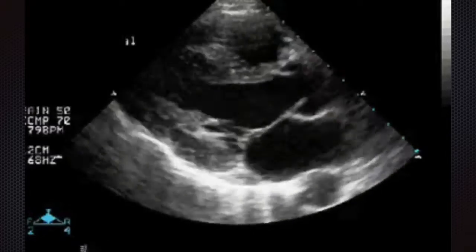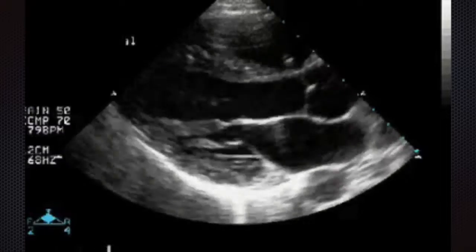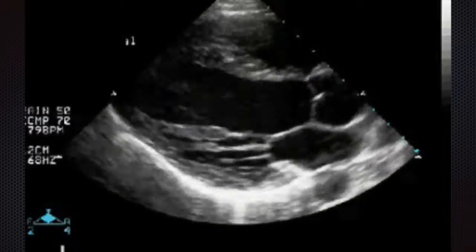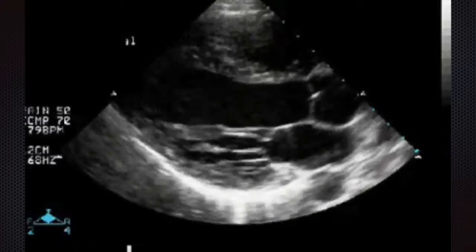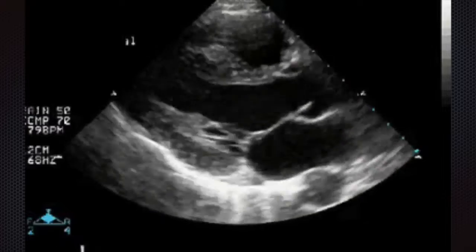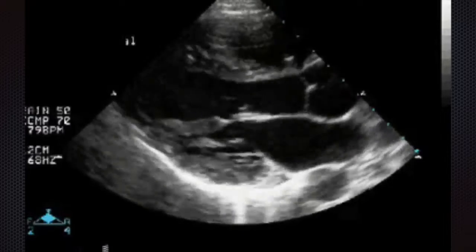However, as you can notice, when the systolic phase occurs, the actual wall thickens. So we normally expect a 30 to 40% increase in the thickness of the left ventricular wall during systole. Now the left ventricle has fibres that run in different directions embedded in it, and some of them cause thickening, some of them cause radial contraction. So as you can see, the actual internal width of the chamber is reduced by about a third during systole, and so that's easy to see on this view.